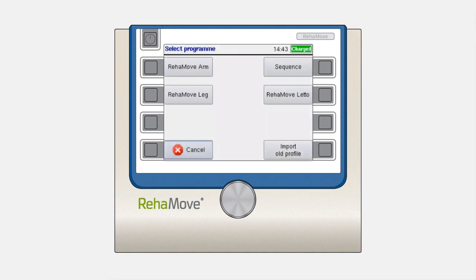To create a ReaMove Leto Leg training program, press the second button on the right. The next window will give you the opportunity to choose between Adaptive or Constant mode.